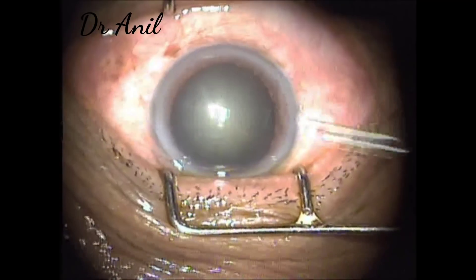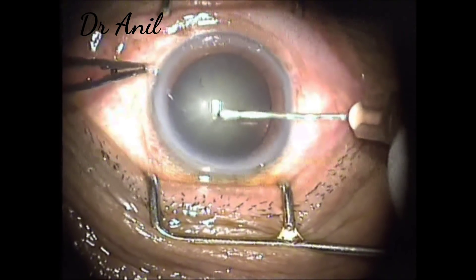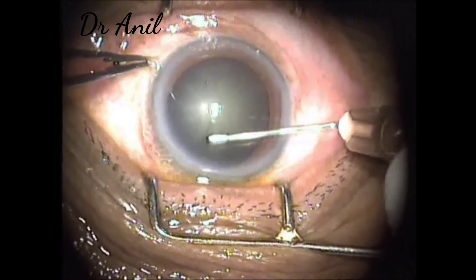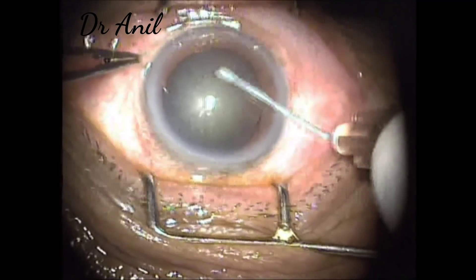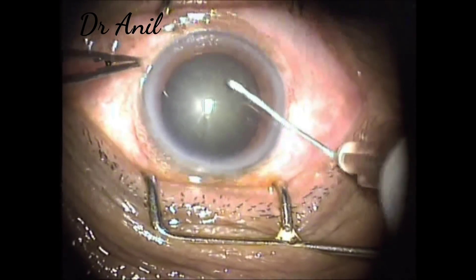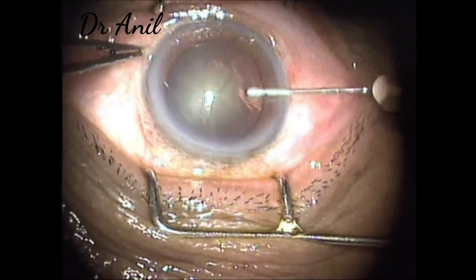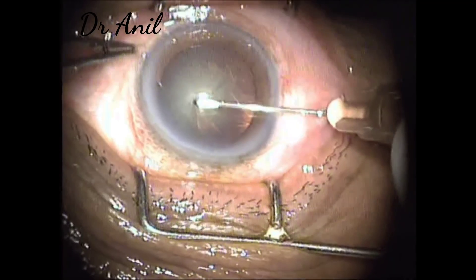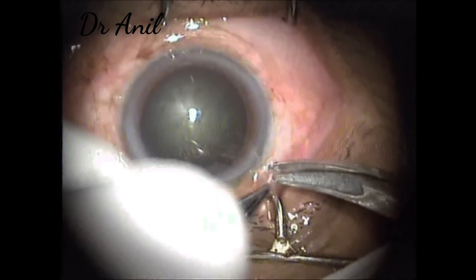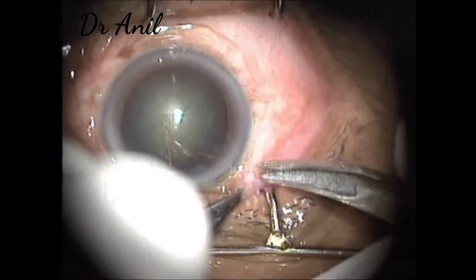Now this is another case of cataract in which the fundal glow is seen, so I am not staining the capsule with trypan blue. The capsule is incised with the 26 gauge needle and the rhexis is made. I normally try to do the rhexis in a clockwise manner. Now this is complete. So the conjunctiva is incised and a fornix-based flap is made again.